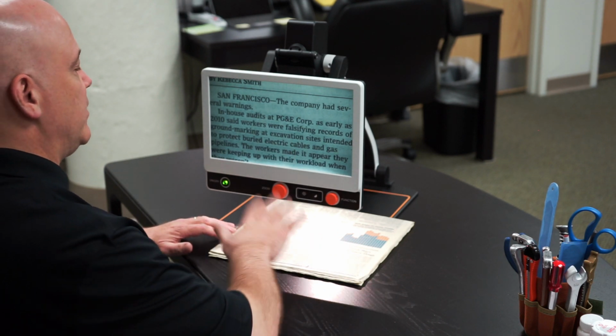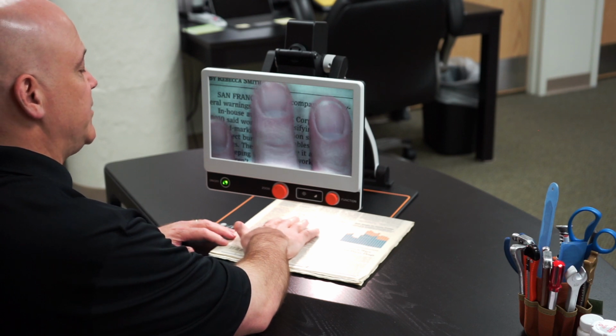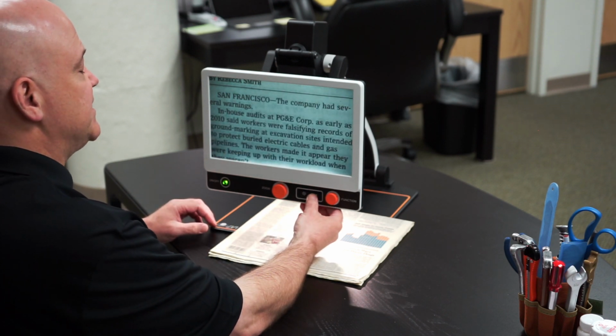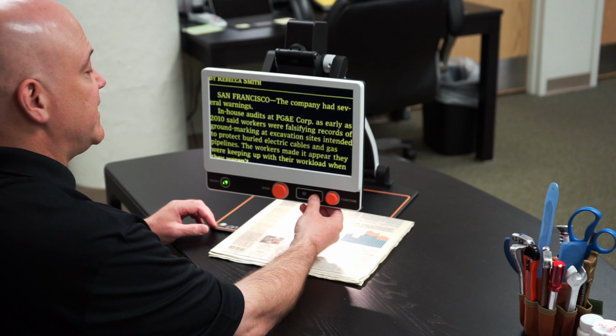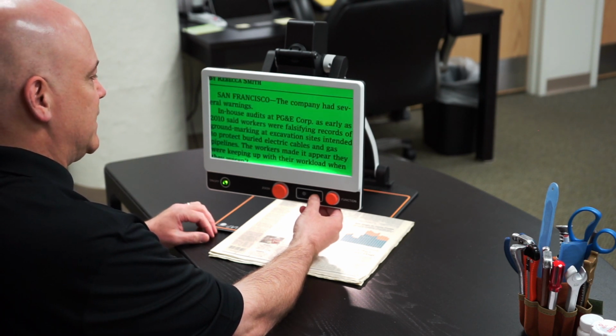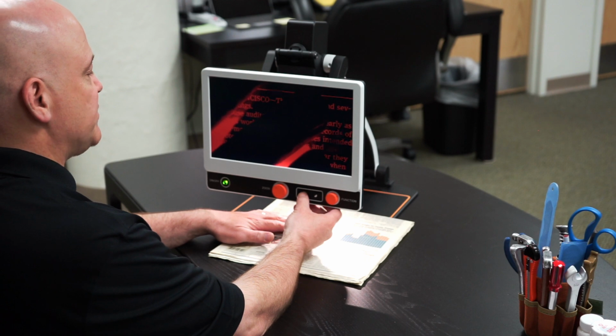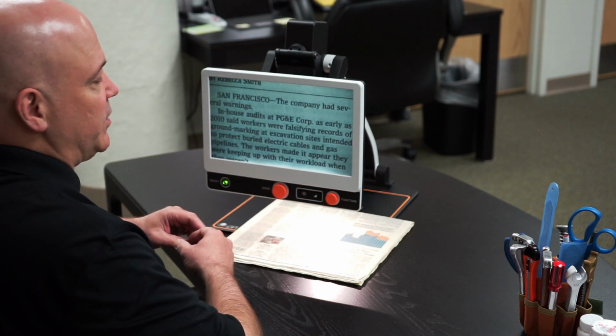It's in that color mode, and you can double check that by always taking your hand and seeing it in natural color. If I wanted to, I can always change the backgrounds to different false colors. So this one's yellow on black, and you have black on green and green on black, and on and on. But if you ever wanted to return to the full color, just press the other button. And that's the whole unit.